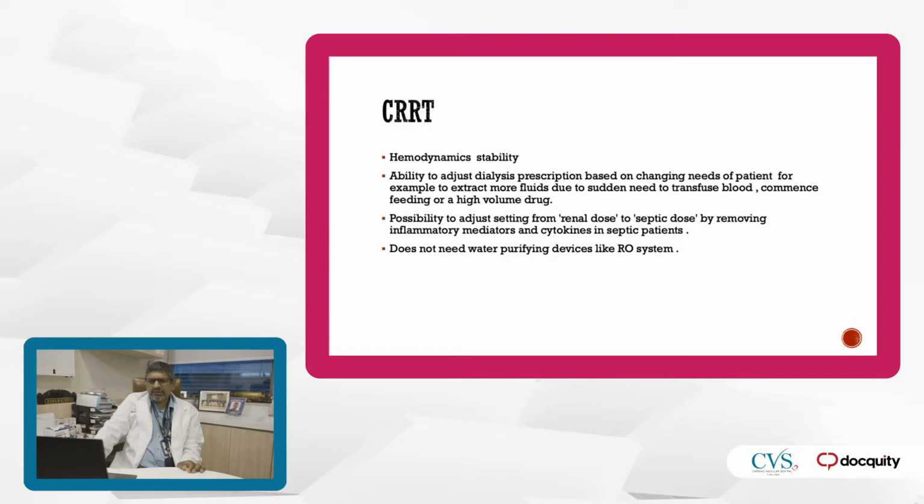CRRT, the continuous renal replacement therapies, have the main advantage of being less stressful on the hemodynamics of a patient, especially patients in shock. CRRT techniques do not affect the blood pressure as much as intermittent hemodialysis. The other advantage is that we can change our dialysis prescription according to the patient's needs. If the patient needs extra fluids removed later, we can do so because it's an ongoing process.